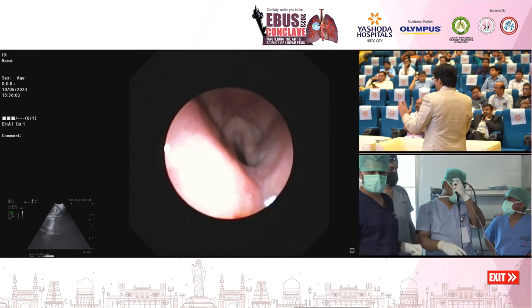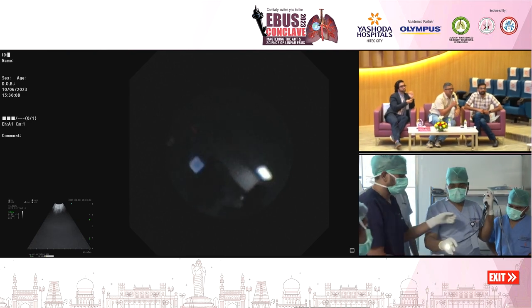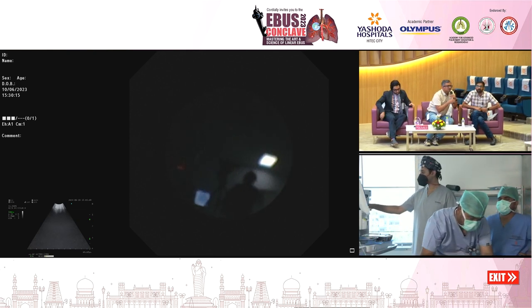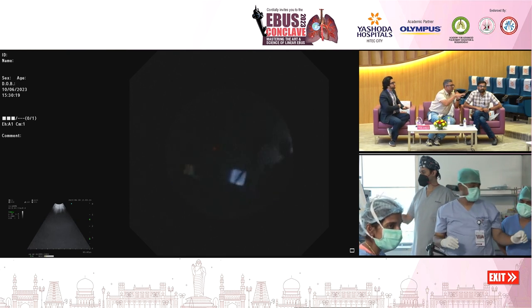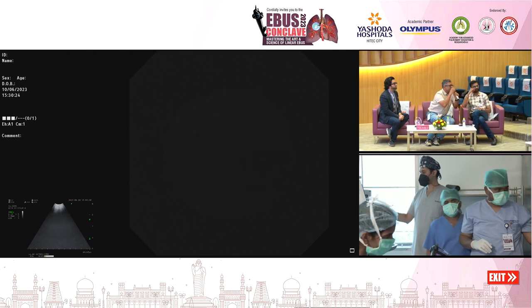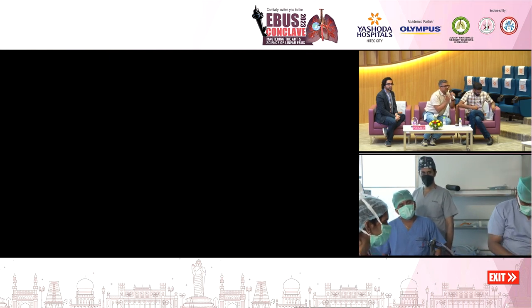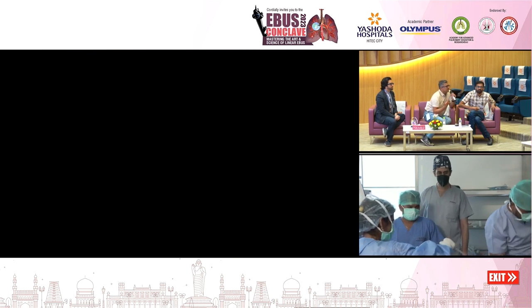I think just to add to what you already said, Nagarjun, in your own paper, you have an algorithm where you say that where there is a negative ROSE, that's when they try to attempt one of these techniques. So please do not think of these accessory additional techniques as your main EBUS technique for doing your biopsies. So if your ROSE is negative, or if you have an EBUS which is first negative, and then you decide to do one of these accessory techniques, I think that must be fair as of now. With more RCT data coming out, I think things will become clearer.